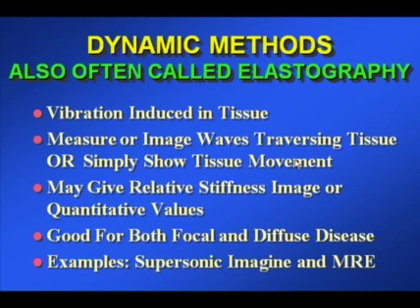And a couple of examples of systems that do this are the SuperSonic Imagine machine, which creates shear wave images using a dynamic method, and magnetic resonance elastography, which also measures shear wave velocity.